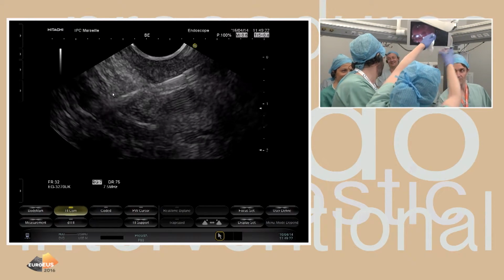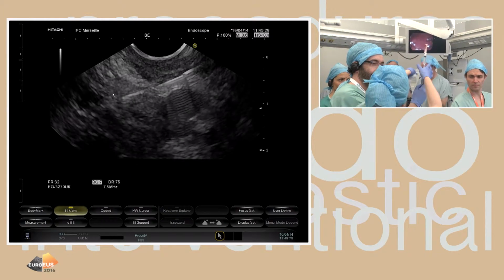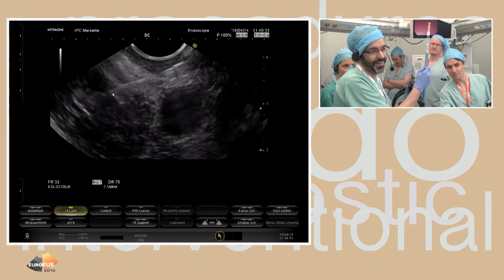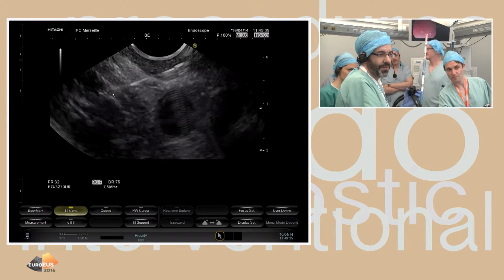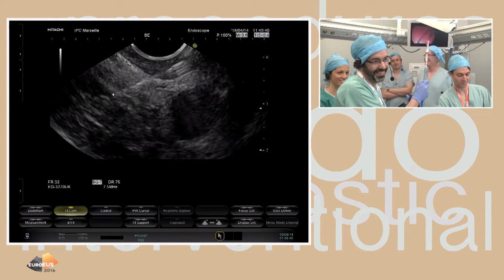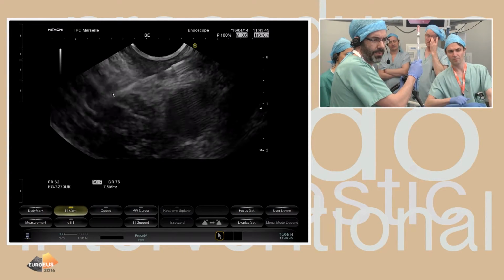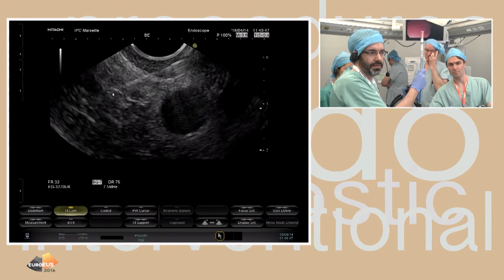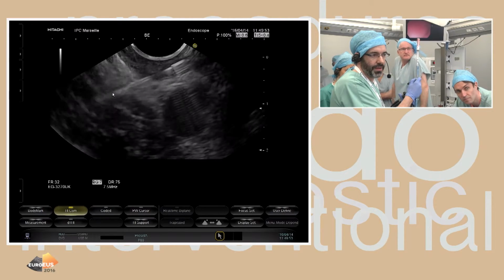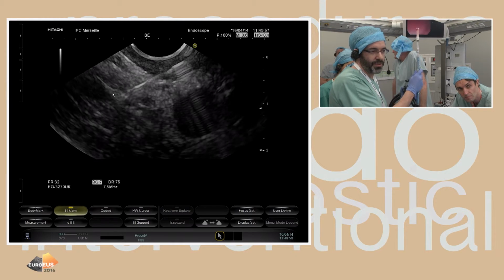So this also provides a lot of information. The dancing nodule, yes, so that is more related to mucin. So we will just try to improve. Better than contrast. Yes. Finally. Okay, so we're really now inside, and it's really moving. This is more linked just to a plug of mucin. So I think it's, as Mark says, even better image than what we obtained with the Sonoview.